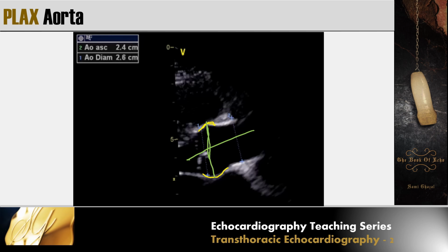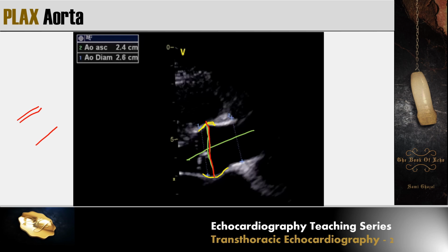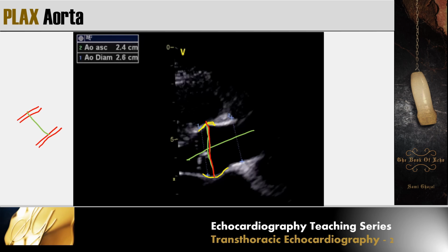And the measurement here has to be leading edge to leading edge. Let me show you what I mean by leading to leading, or outer to inner. This is outer to inner. This is how we measure it, because this is how we have our reference values. This is how it was originally measured, and it correlates very well with the measurement of CT scan.